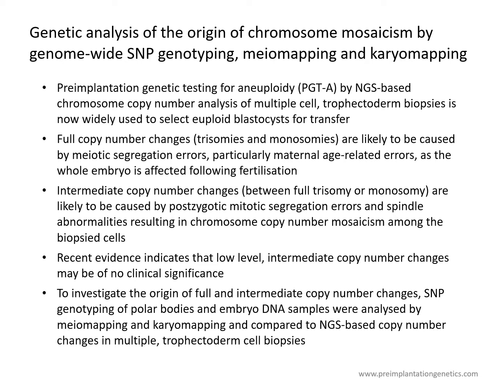Now, it's important really to distinguish intermediate copy number changes from full copy number changes, because recent evidence indicates that low level, at least, intermediate copy number changes may be of no clinical significance. And we want to avoid, if possible, rejecting embryos for transfer that actually might be viable, as has been shown by many studies now.